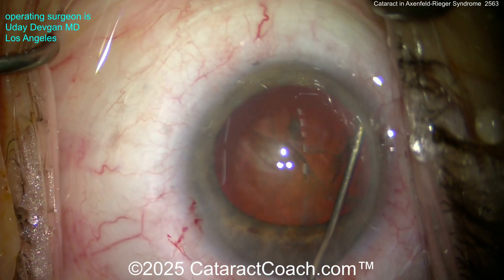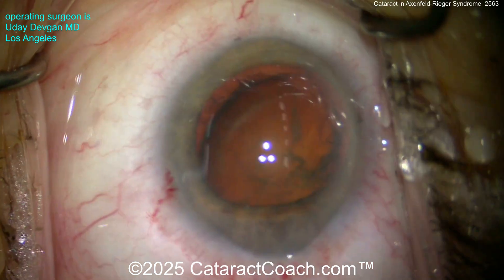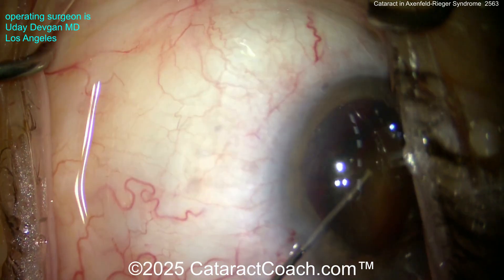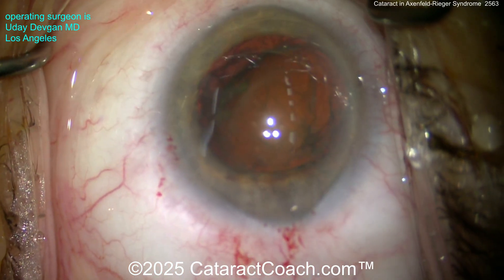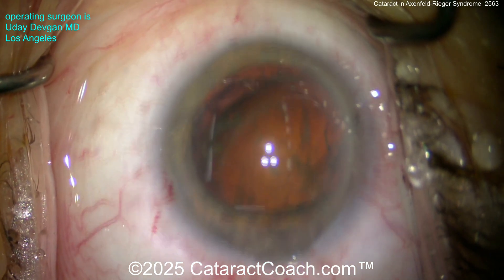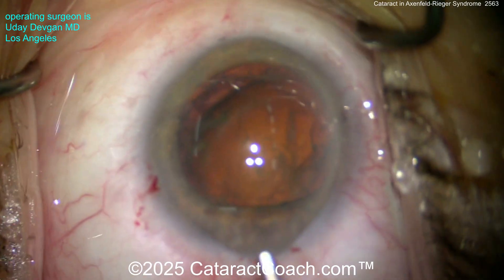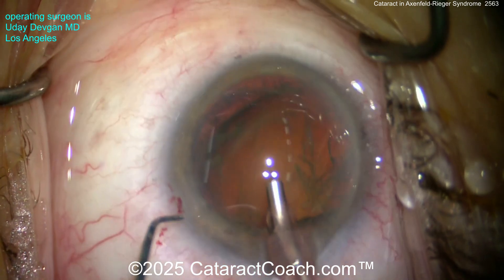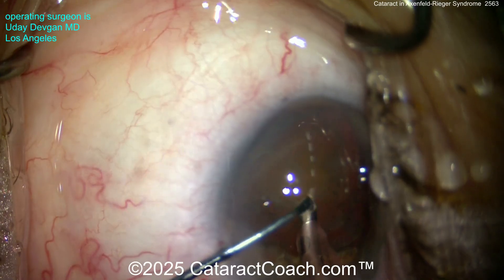Now I'm going to do a very gentle hydrodissection, very slowly. I want that nucleus out of the bag. I'm not sure what we have in terms of zonular integrity. The rhexis looked okay; the nucleus wasn't shaking and there was no phacodonesis. A little more viscoelastic to protect the corneal endothelium. The patient also has an irregular degree of astigmatism — there's some regularity luckily in the central three or four millimeters.